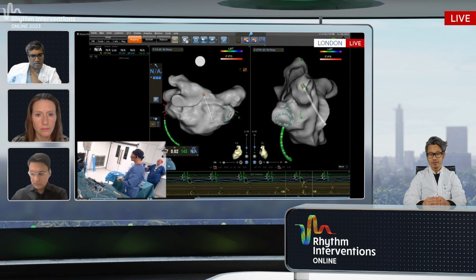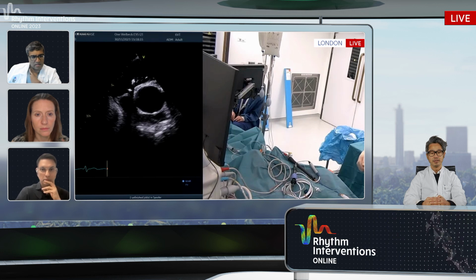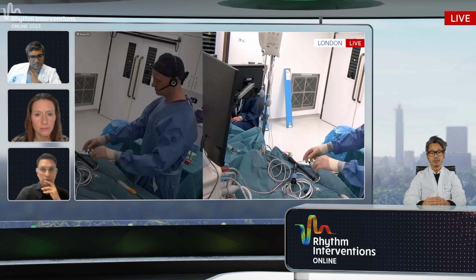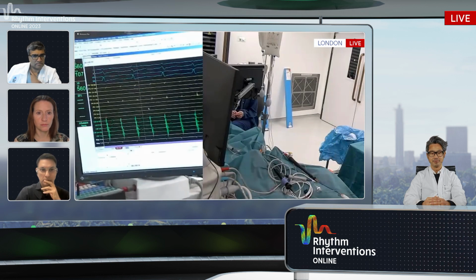So can we have the electrograms on there as well, please? Let me know when you see those. Now we see it.